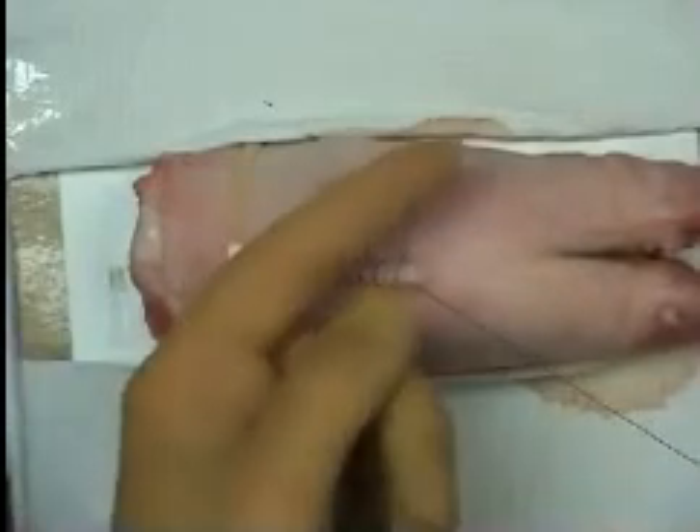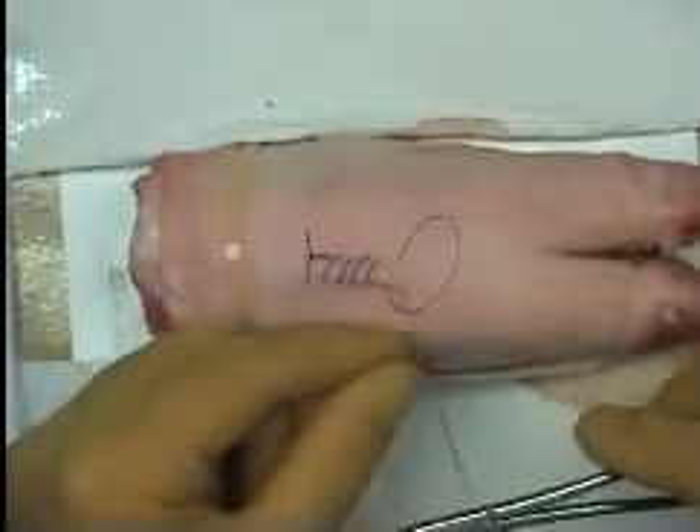At the end of the suture line, a reef knot can be formed between the bite and residual loop of suture.